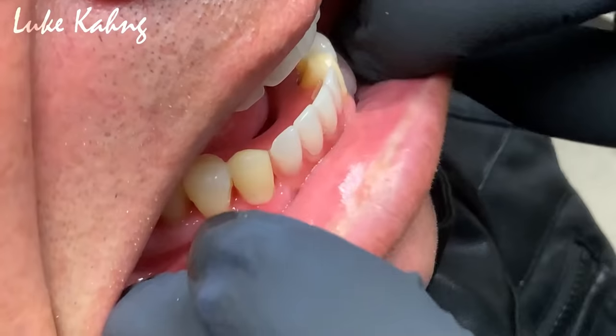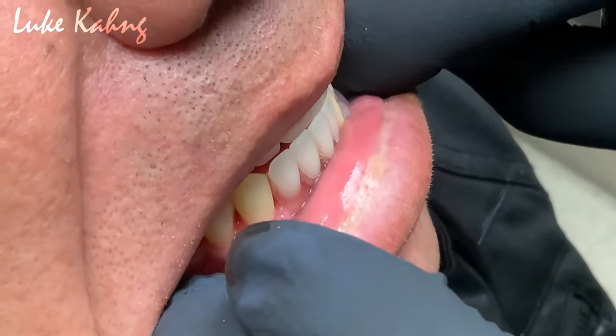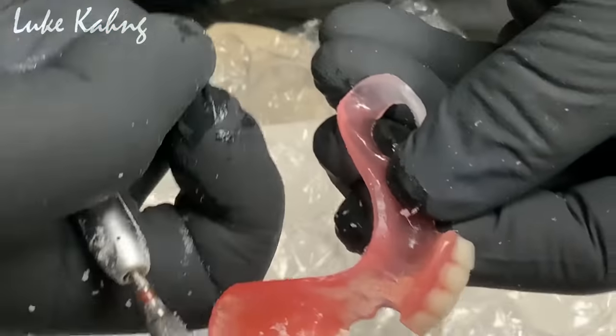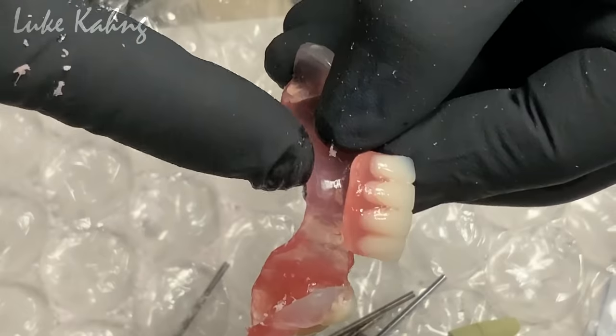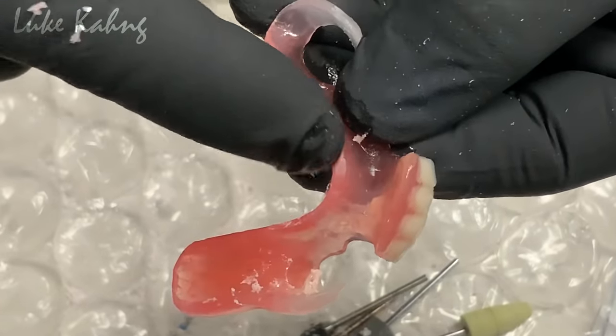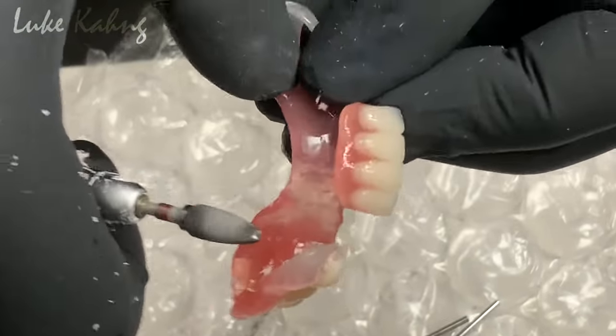That's good. You know, you want to make small adjustments. So we're going to make some small adjustments. We'll get right back to you on this. Okay. Burr, if you're not using that red one again, you're going to make a mess out of this. And look at how it leaves my TCS. See that? It's almost like polished.